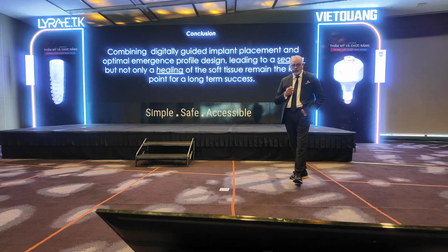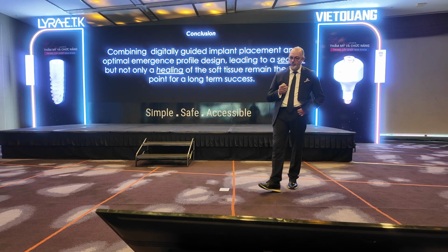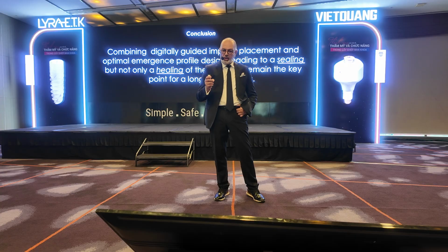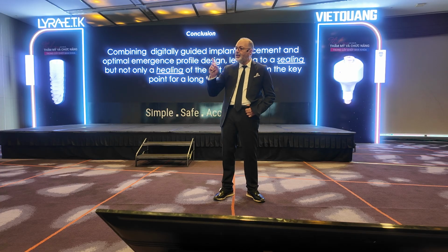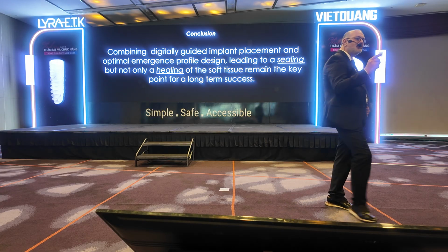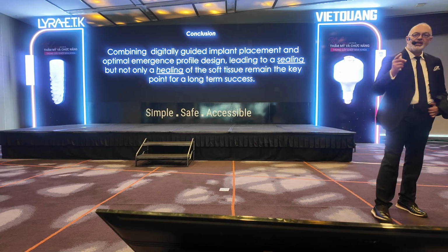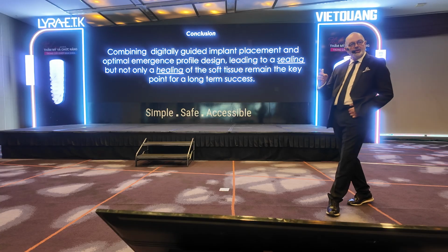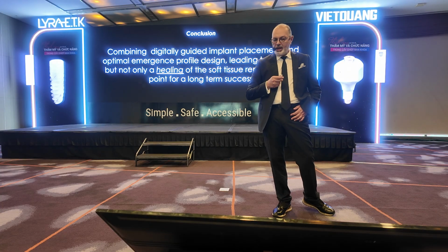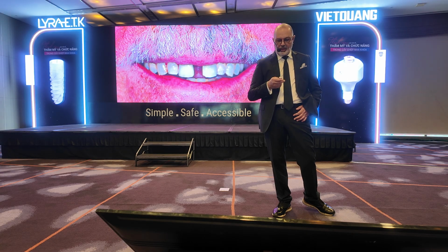So, my conclusion will be combining digital guided implant placement and the optimal emergence profile design leading to a sealing, not a healing. I don't need to have a healing because my healing is very weak, and any kind of bacteria accumulation will lead to a resorption of my bone. So I don't want a healing, I want a sealing.